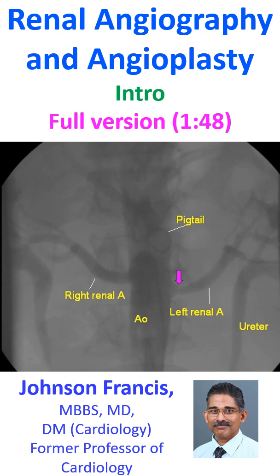Here is a descending aortogram with pigtail catheter showing both renal arteries arising from the aorta. The left renal artery shows narrowing in the proximal segment just after the ostium.